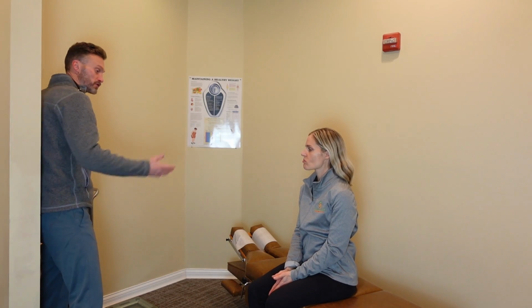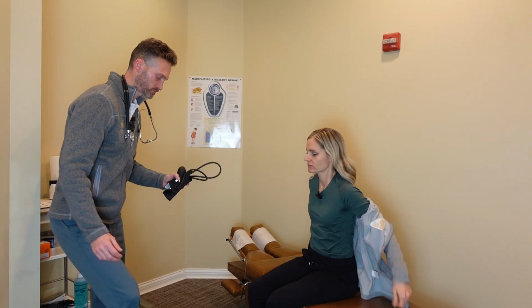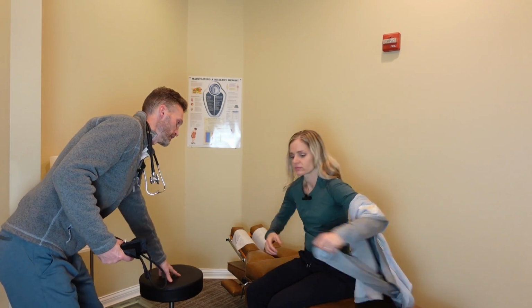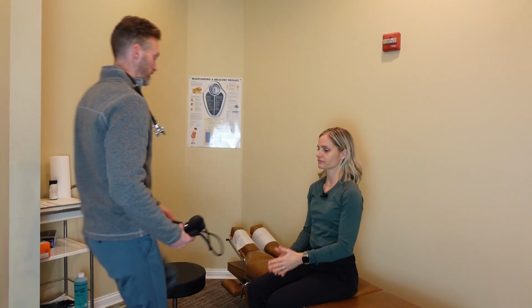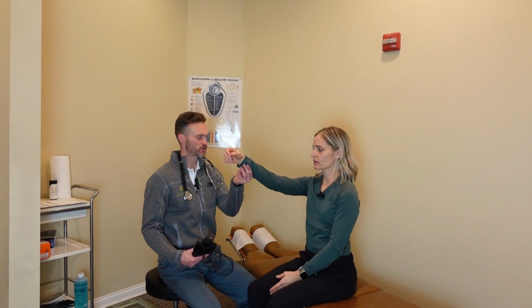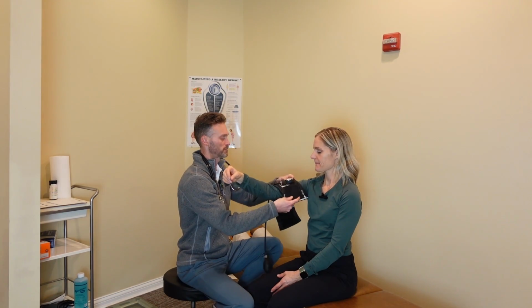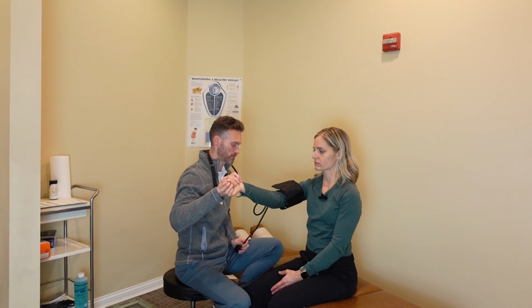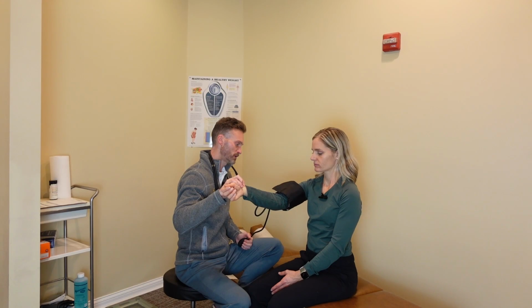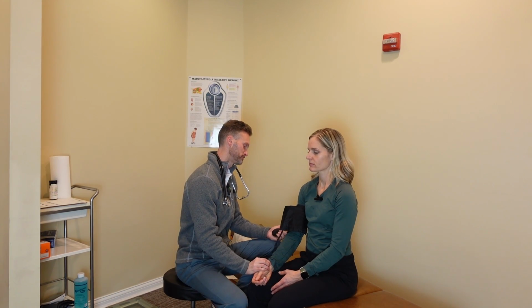All right, so the first thing that we're going to do is your blood pressure. So if you could just take your jacket off for me. And then I will set it over here, out of the way. And what I'm going to do is take this arm and just have you hold your arm right like that. And now just go ahead and drop your arm down and relax.